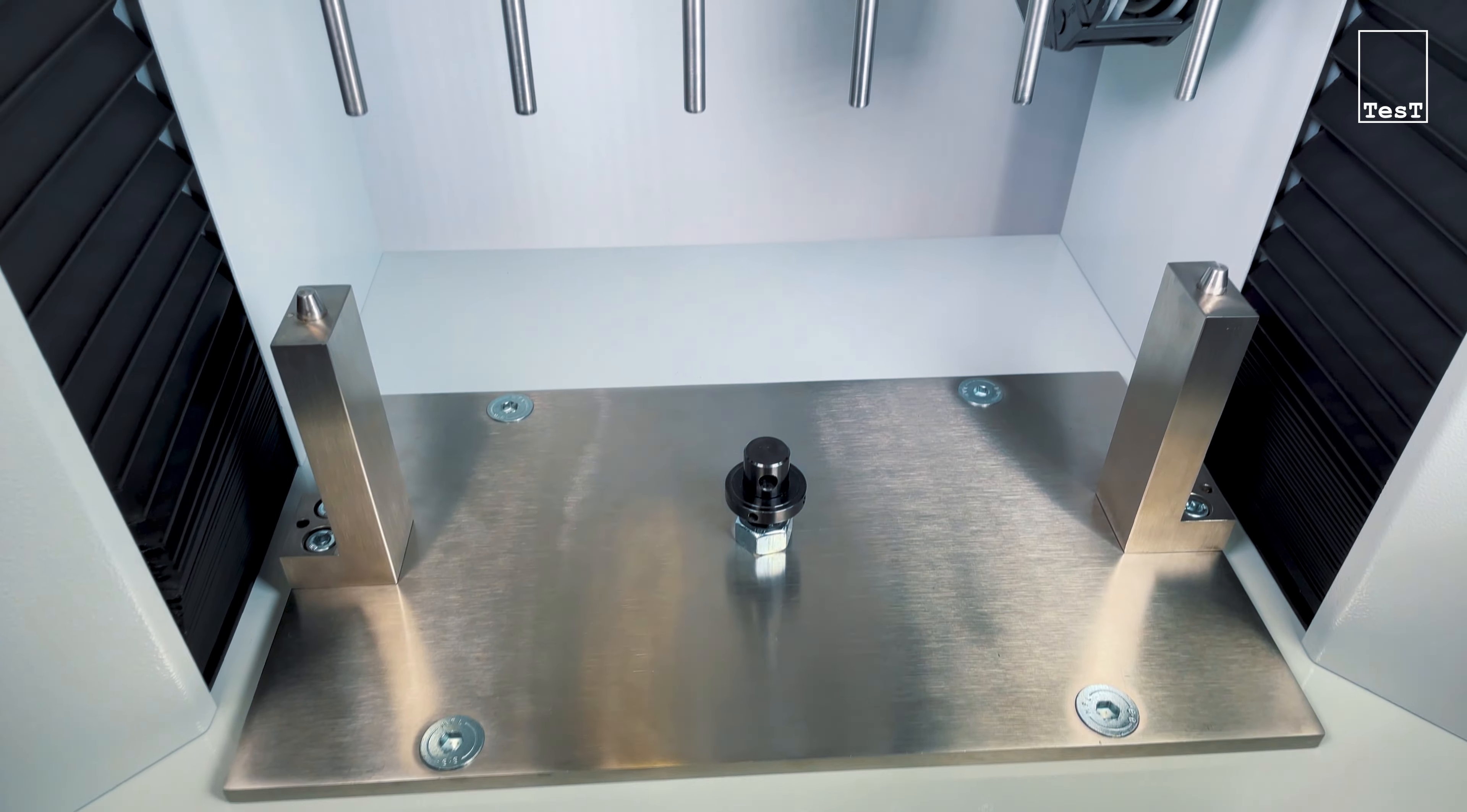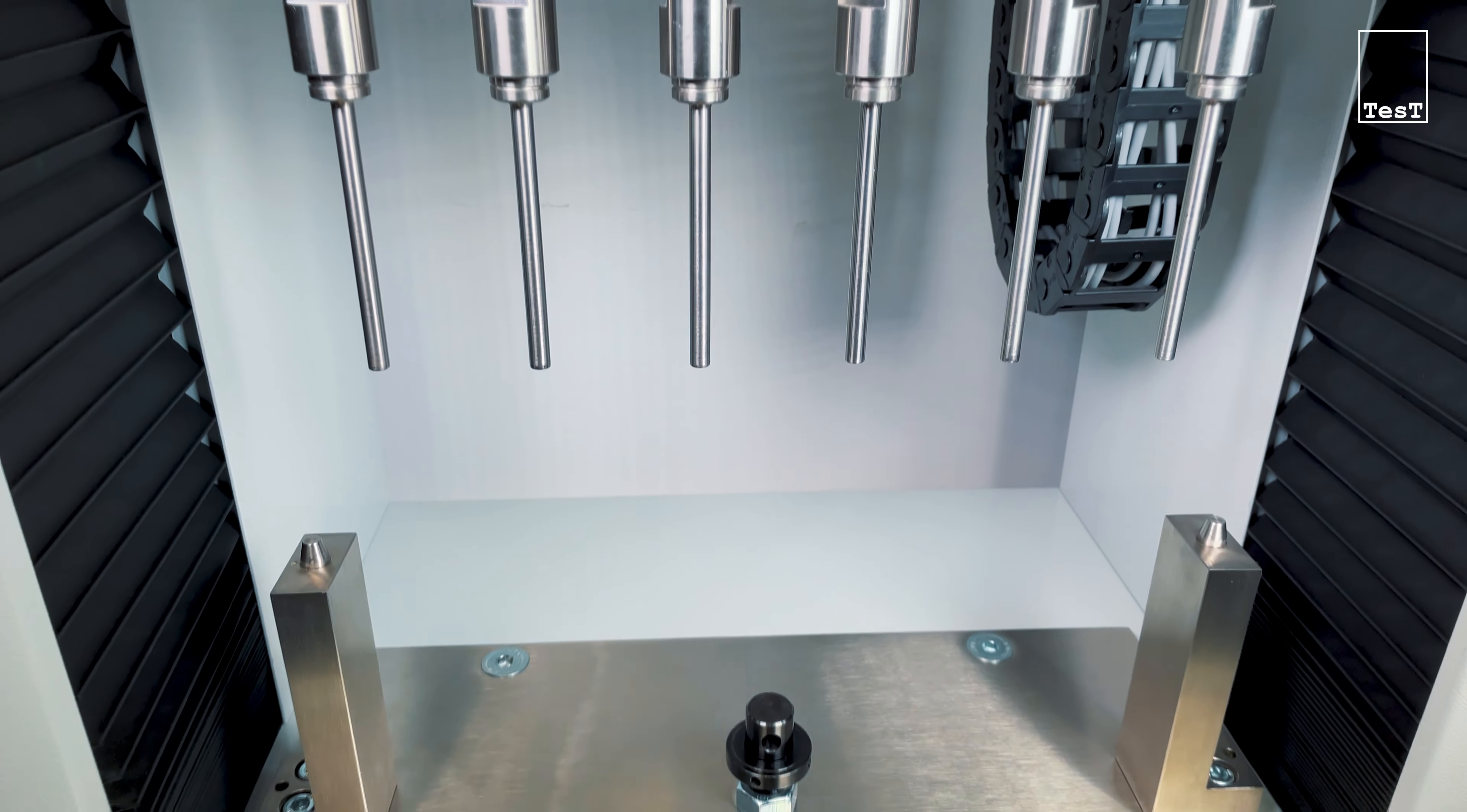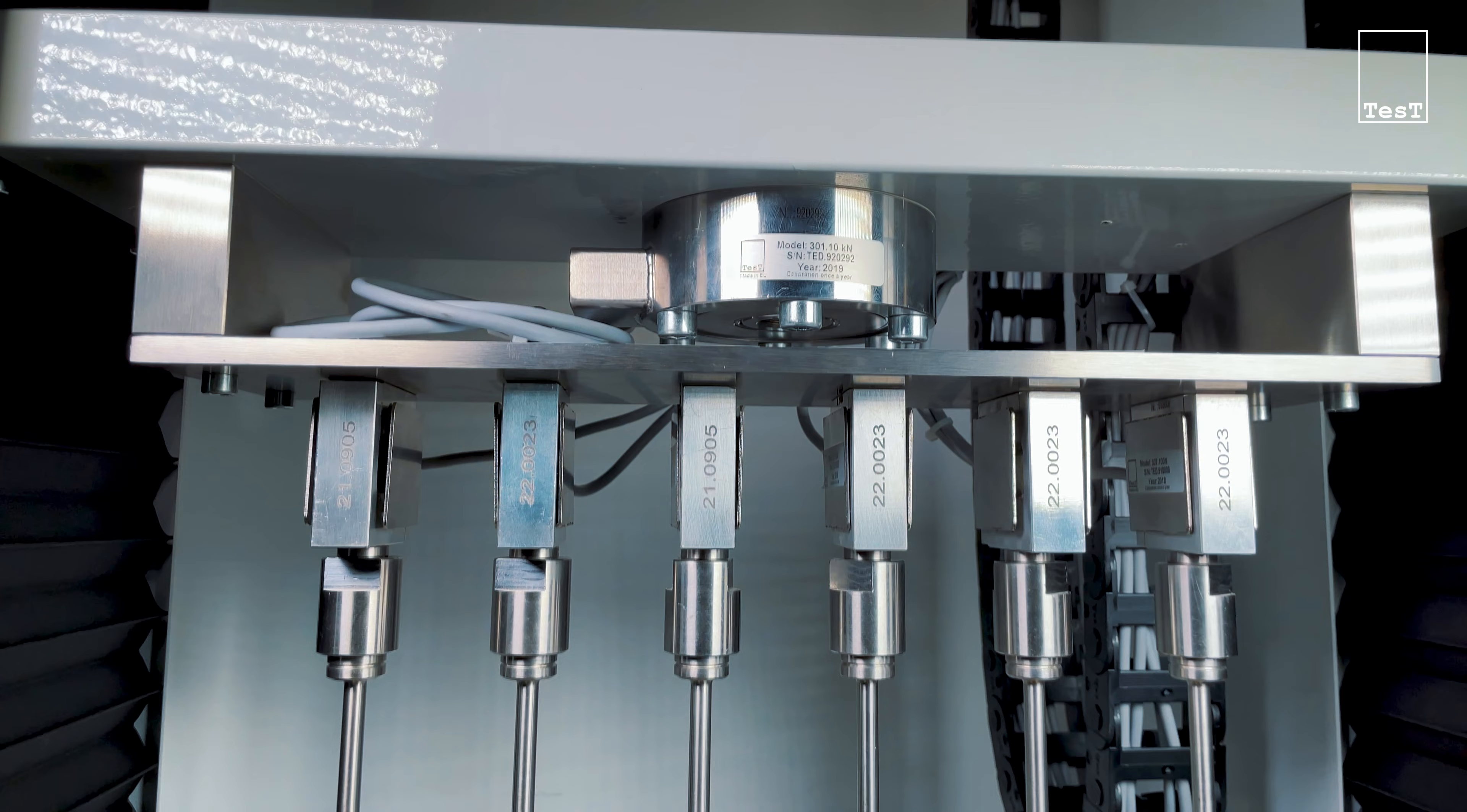The tools are from stainless steel. On request, the entire machine can be validated for cleanroom operation.